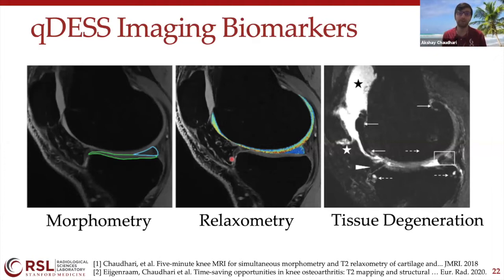So our primary goal is to make sure that the repeatability, as well as the reproducibility of this method, and the coefficient of variation that we get for both are actually lower than those changes that we see in disease activity. And that seems to be the case so far. But we're never happy with that. We're always working on new methods to make our imaging faster as well as more stable.